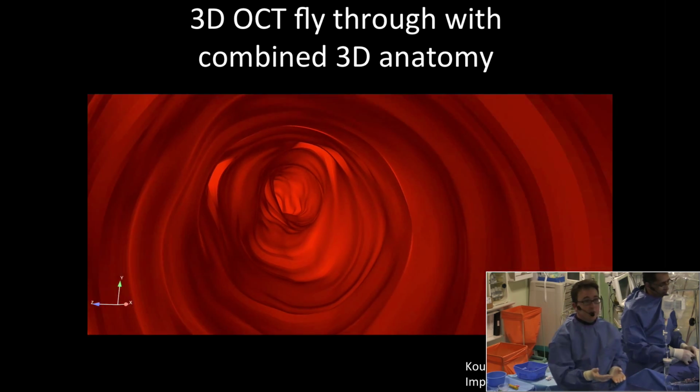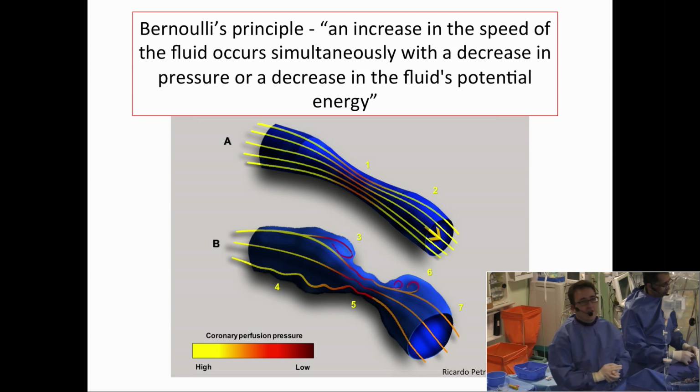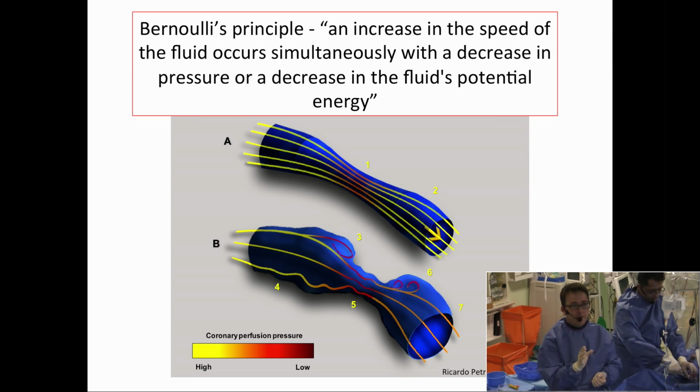Now if we move on, we can see that using the pressure wire essentially enables us to differentiate flow which is normal but just within a smooth stenosis, which you see at the top, and one from a kind of craggy diseased vessel at the bottom. Now why this is important is both of these two arteries have the same MLA, so the MLA is the same, but the one at the bottom has a significantly bigger pressure drop.